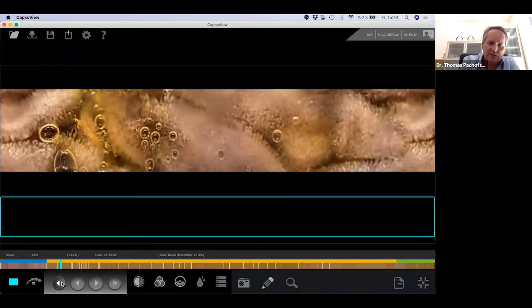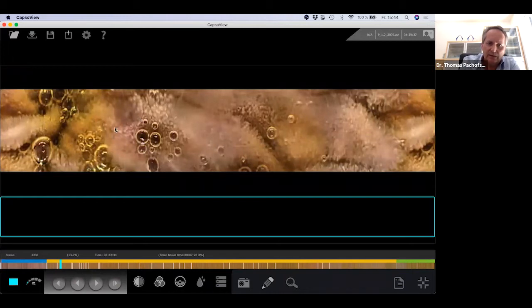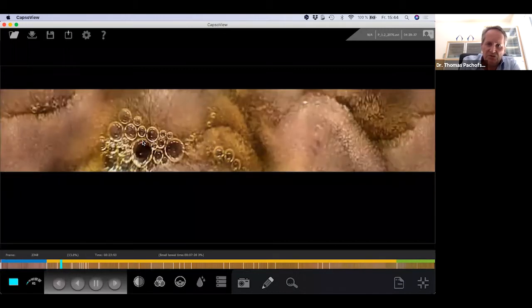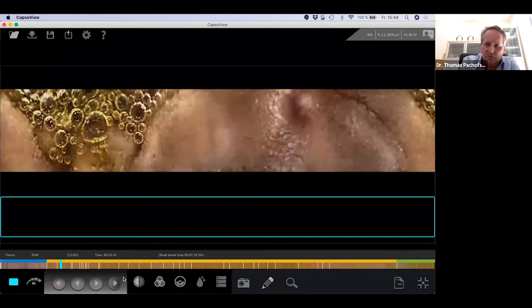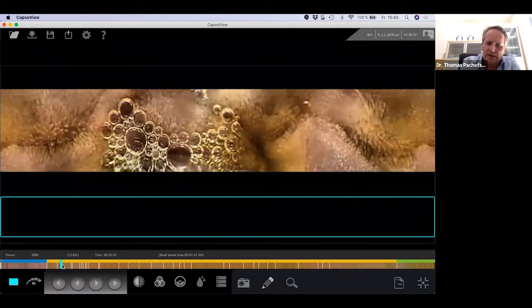And you can see it's not very clear, but here is an area, it looks different than the rest, yeah? So if you see this first, you will say, okay, I don't know what's going on. But here we have a second one. It's also not so clear. It's because the capsule is near to the mucosa. So that's why in this area, you can't see really, they are flattened by the capsule. But you can see here, there is something, it looks not healthy.